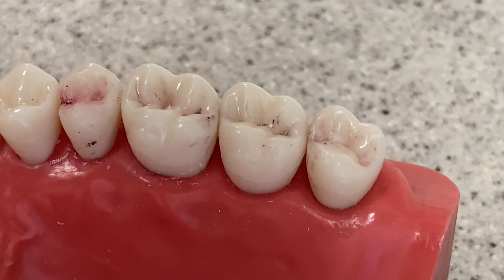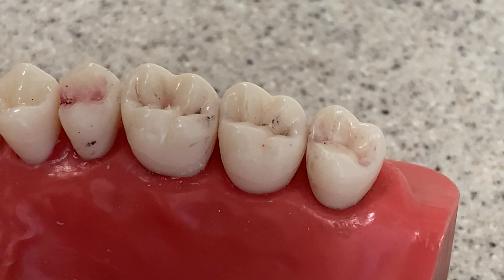So here we have Larry. I call this Larry — the name of the person who generously donated the typodont for use in these videos. We'll call the typodont Larry in honor of Larry.